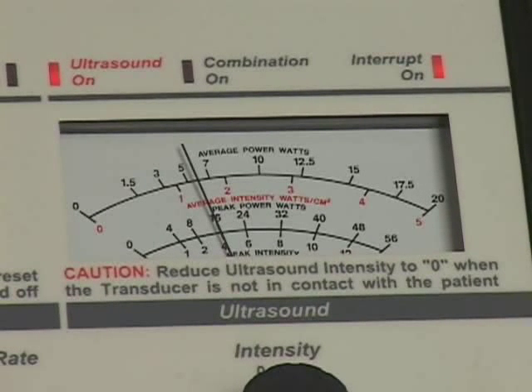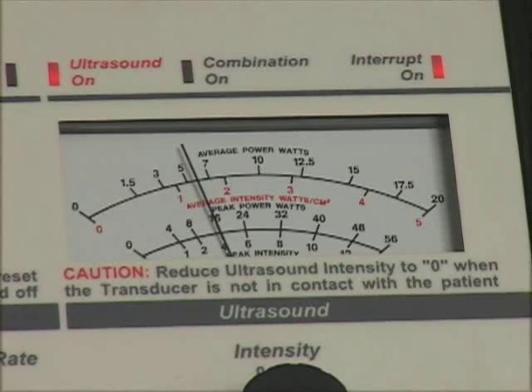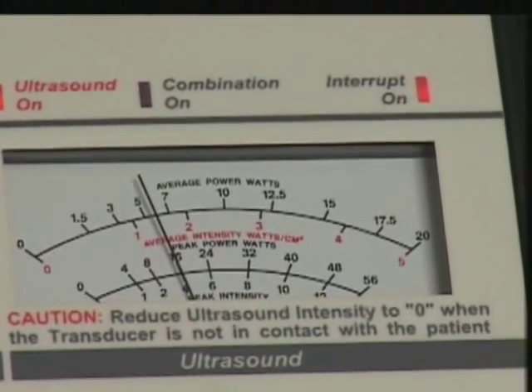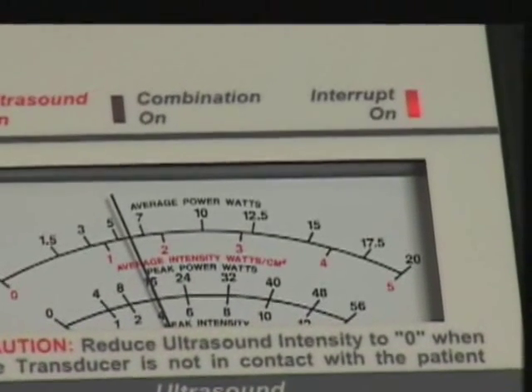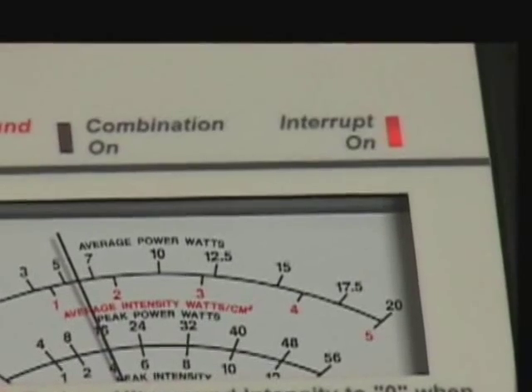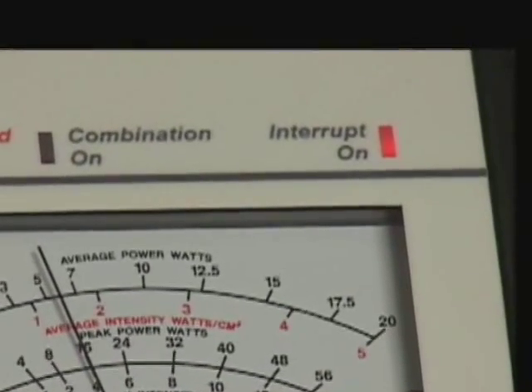When the ultrasound interrupted output control is rotated clockwise, enabling an audible click, the interrupt on indicator light, located above the upper right corner of the ultrasound meter, will illuminate and the ultrasound meter indicator will rise and fall, indicating interrupted cycles, provided the transducer is not in the ultrasound cradle.